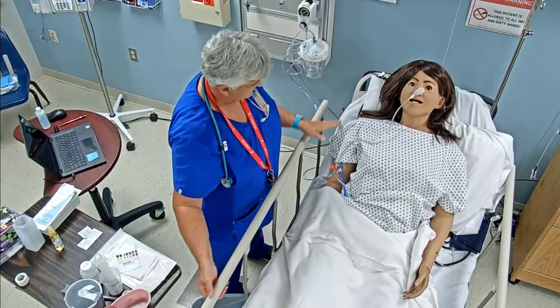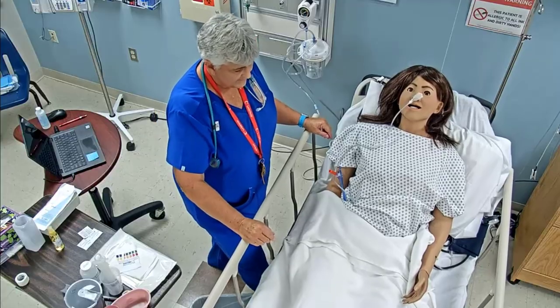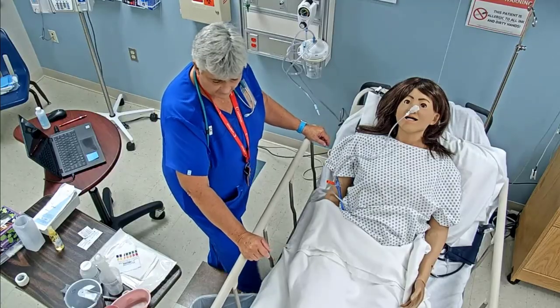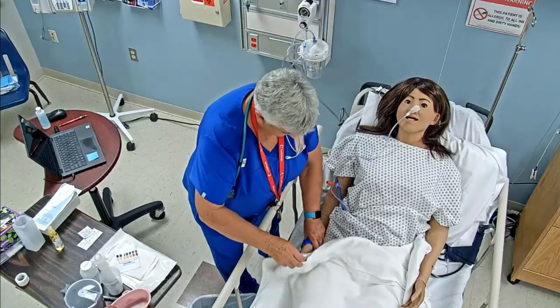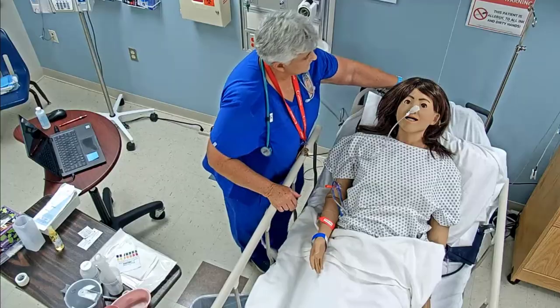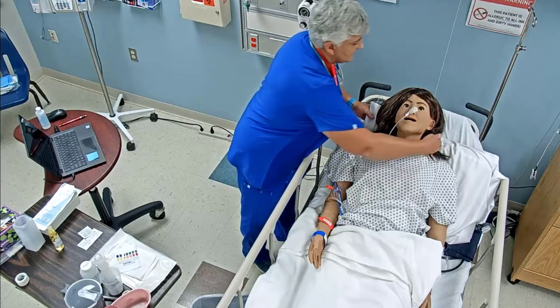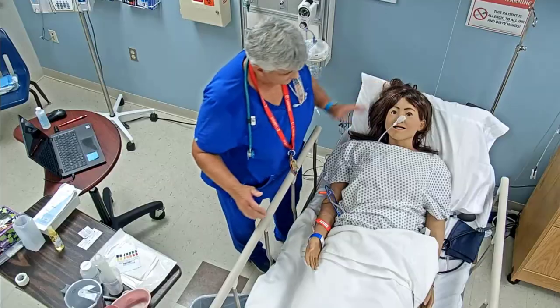Let's put that side rail up. We want to make sure we put the bed in the lowest position. I'm going to get the patient comfortable. Side rails up times two, bed in low position, the wheels are locked, and we've got our call light within reach. How are you doing? I'm going to put your head back; it can't be less than 30 degrees. I can rearrange that pillow a little bit better for you. Are you comfortable?